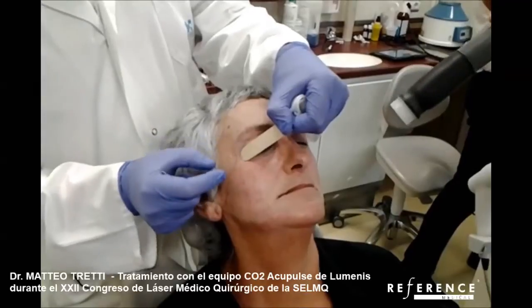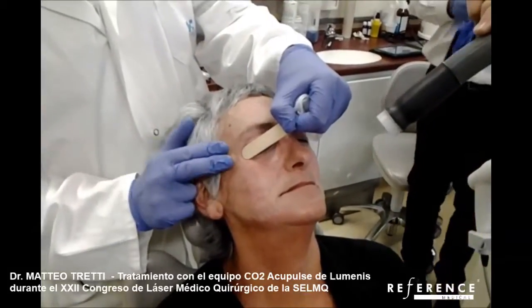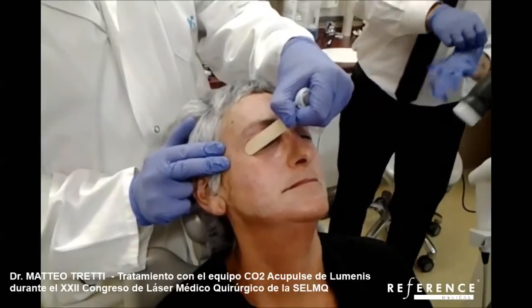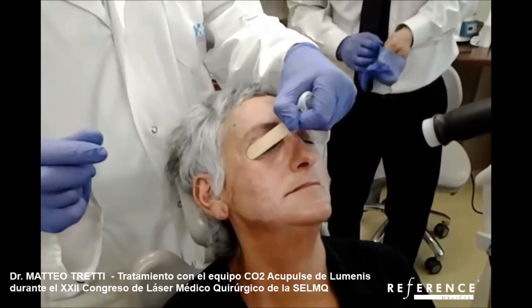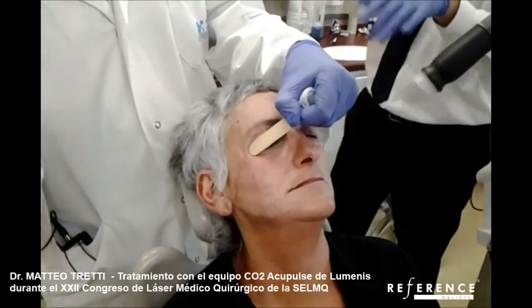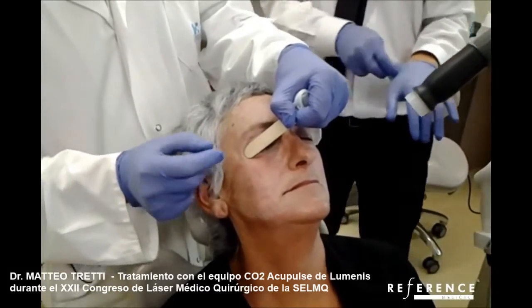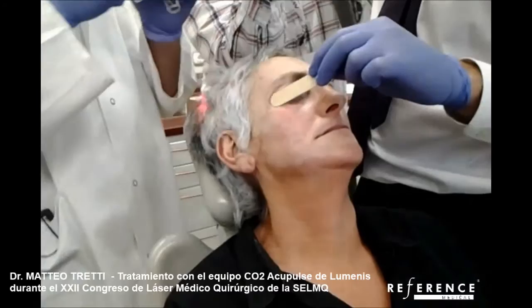Your nose guard has to do that. Then you have to stretch and pull the skin. By doing this you make the skin thinner, and having the skin thinner — without modifying the settings — you can go deeper and obtain a better result. The same thing can be done on the other side.